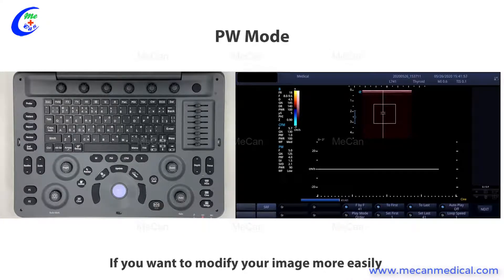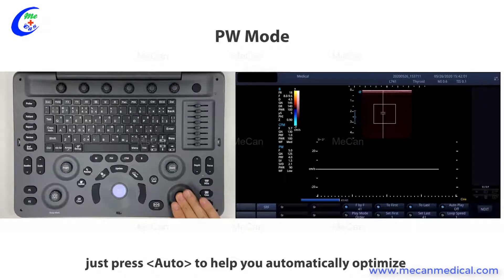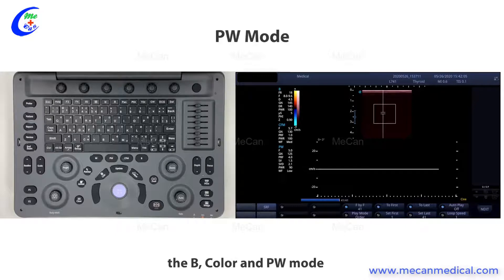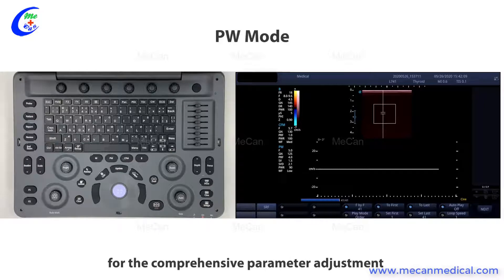If you want to optimize your image more easily, just press AUTO to automatically optimize B-mode, color, and PW mode. It saves your time for comprehensive parameter adjustment.